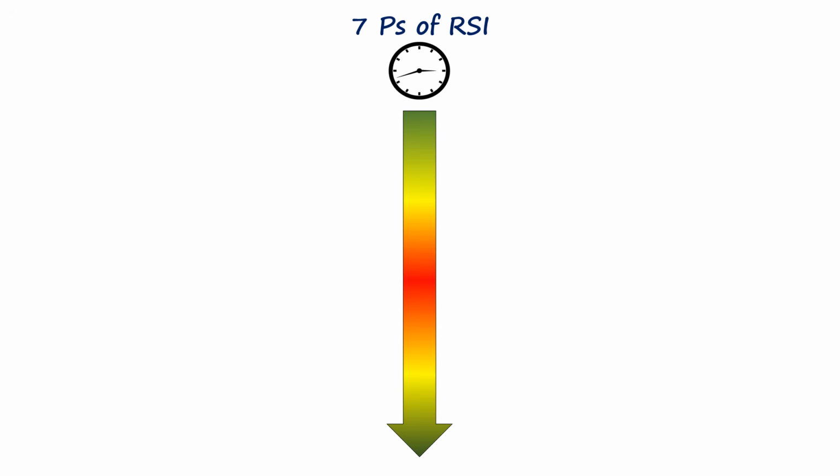When it comes to performing RSI, it's not a one-man show. As the name suggests, we should be able to rapidly perform tasks in quick sequence to achieve successful intubation. So a well-coordinated team and a sound knowledge of the procedure is very important. An easy way to go about it is to follow the 7 P's of RSI technique.